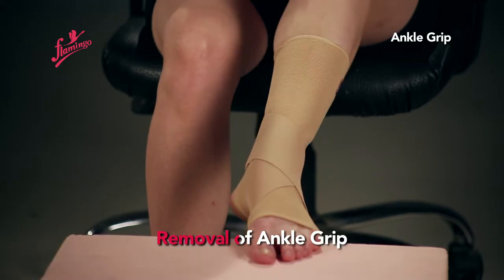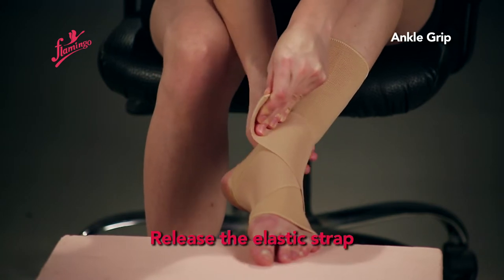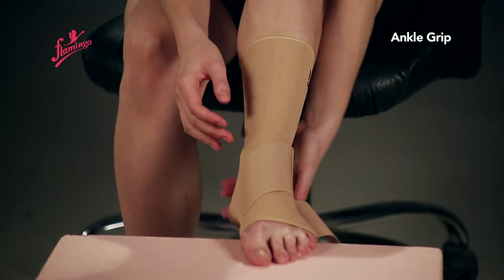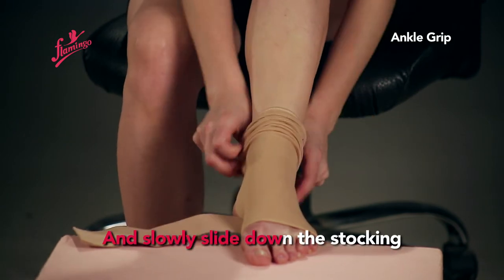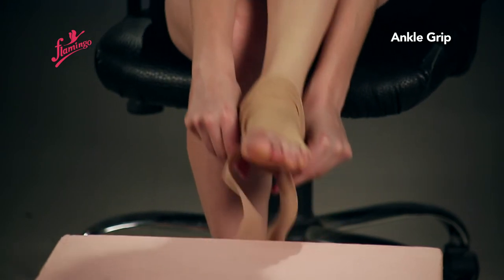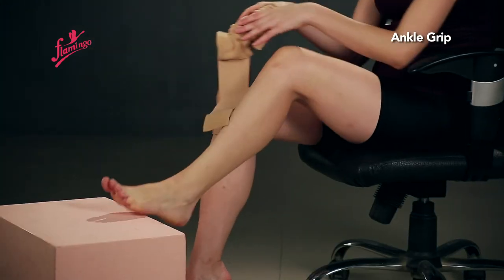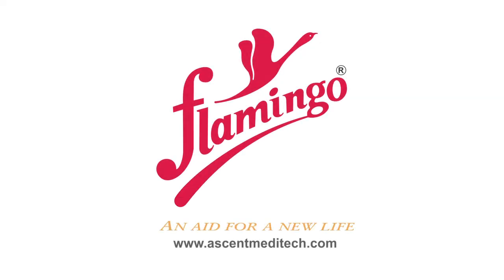Removal of the ankle grip. Release the elastic strap and slowly slide the stocking down. Adjust the elastic strap as needed.